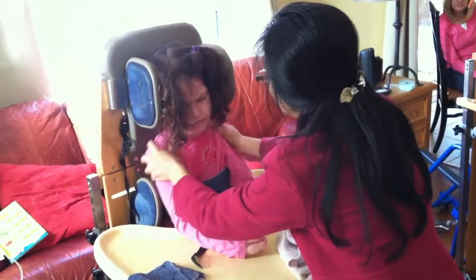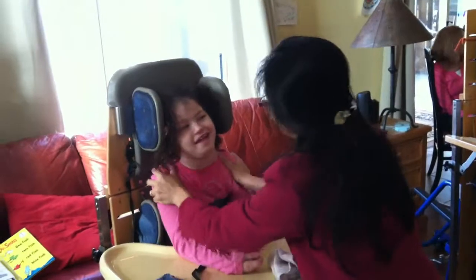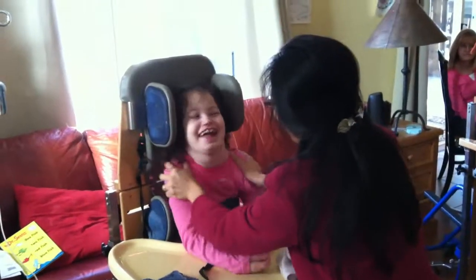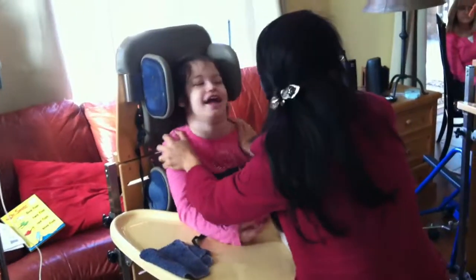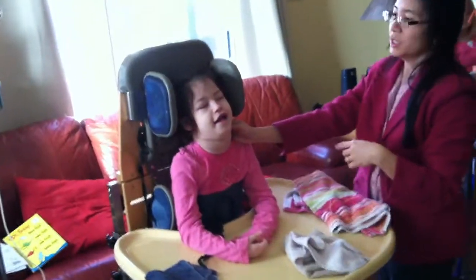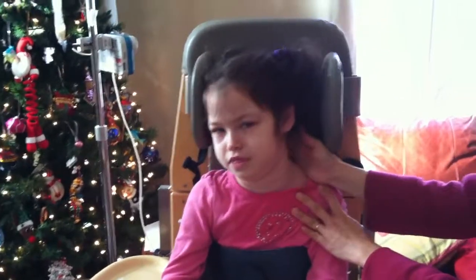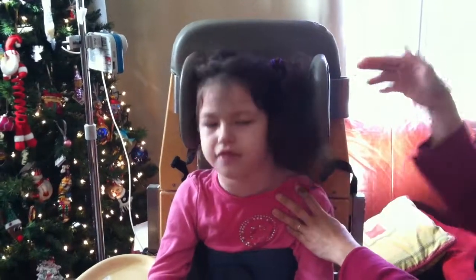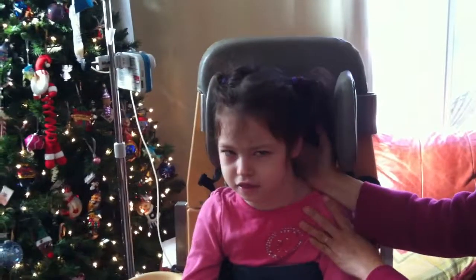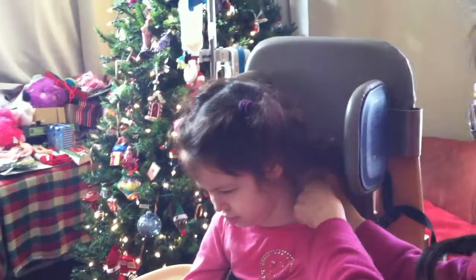You want me to lock the stander? No, that's okay, because I'll be moving her more now. Look at those smiles. With her — with Sidney — see how she reacts. Each of them is going to react a little bit different. And then if you see how she does, she's really sinking to the back. So you're taking your fingers and you're kind of lifting her up like that — pushing her from the back, the base of her skull, pushing up. And that's stretching the muscles and straightening her so that she's not getting that big lordosis in the back.